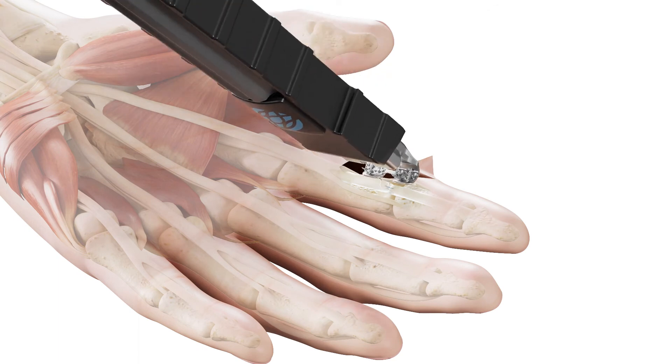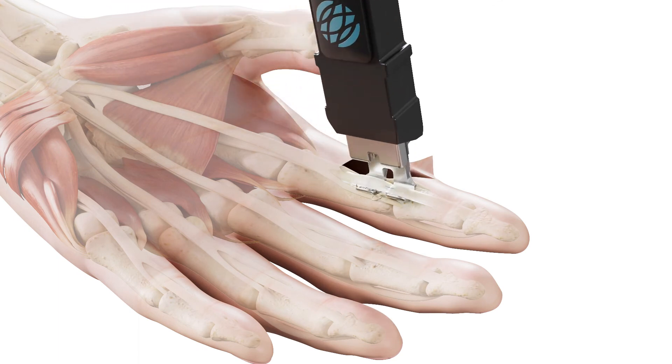Position the tendon in the cradle and fully engage the tendon by rotating the thumbwheel in a clockwise direction until the aforementioned click occurs. At this point, observe the tendon through the viewing windows to ensure proper tendon coaptation and centering in the cradle.